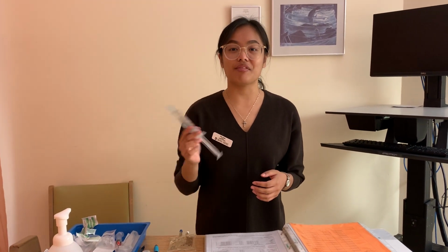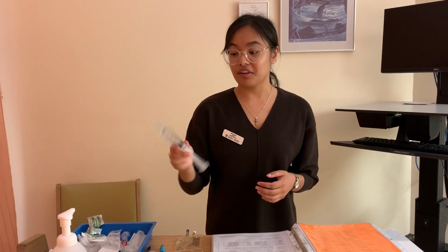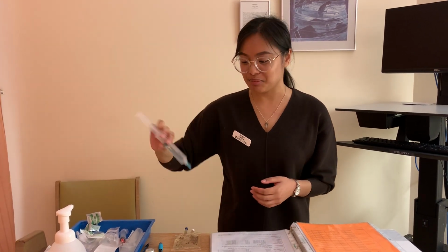I have my diluent. Now I'm going to make sure to mix my diluent to ensure that the medication from the vial and the mini bag has been mixed. Also, I'm going to make sure that there are no air bubbles. Whoop, that sprayed on me.